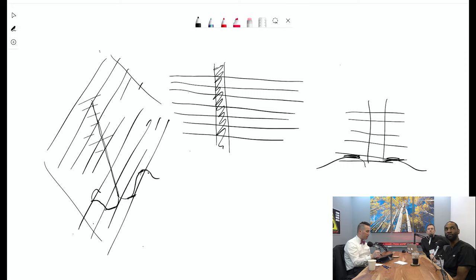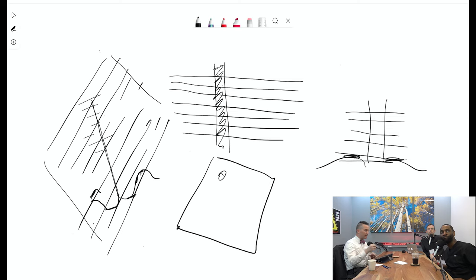Now I would have a problem, but I'm going to triple oblique it. If I'm also looking straight ahead at the coronal, I'm also going to oblique those slices. Same thing. So I want to triple oblique it. I want to make it look really, really gross.